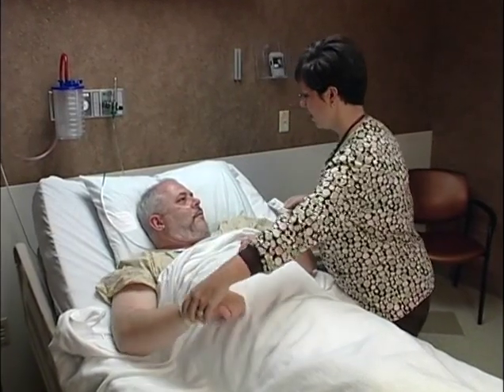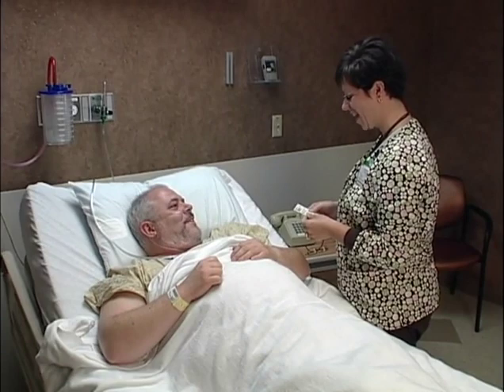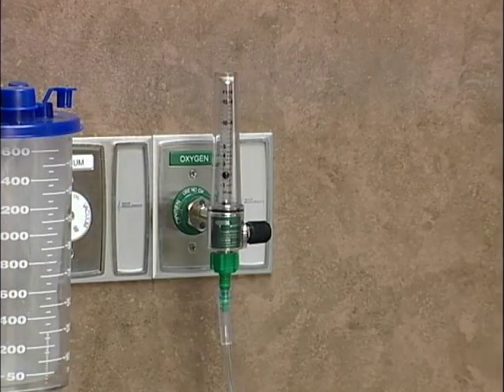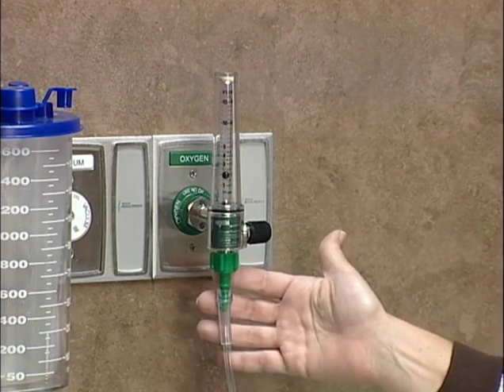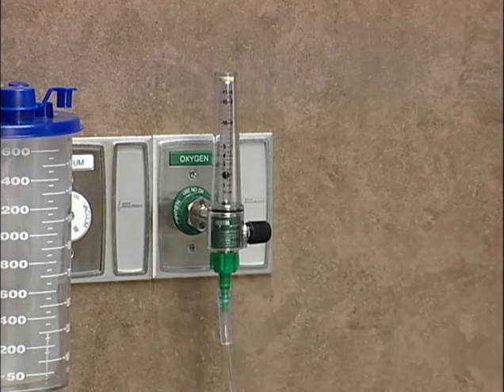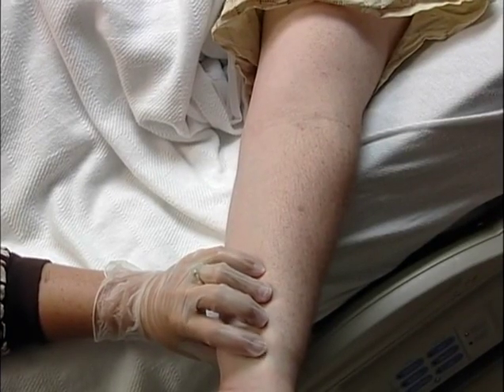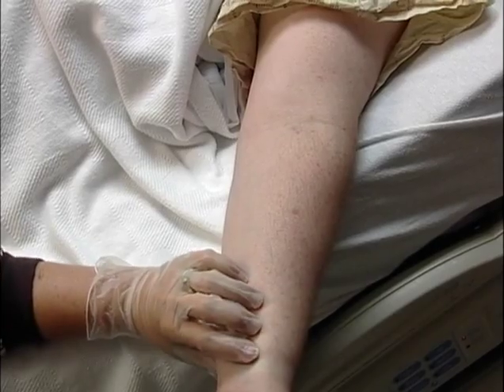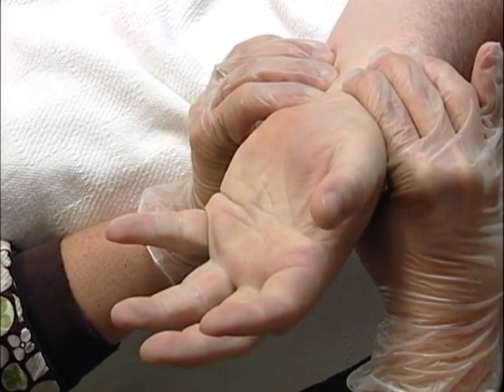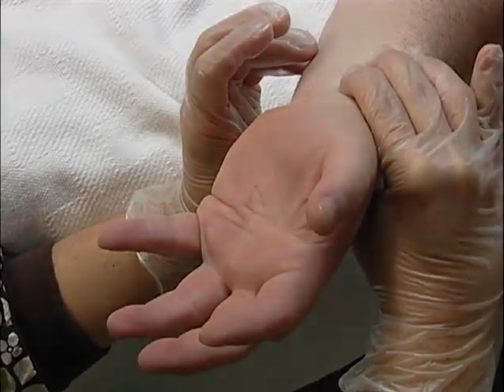Identify the patient properly and explain the procedure. Gather necessary equipment and supplies and assure that the respiratory conditions have been constant for at least 20 minutes. Document the therapy or respiratory conditions. Position the patient and select the site, giving preference to the radial artery. Perform the modified Allen test. If positive, proceed with the puncture to the radial artery.